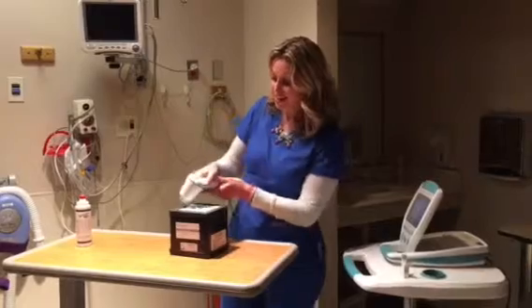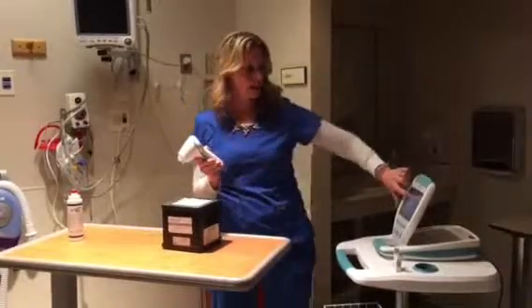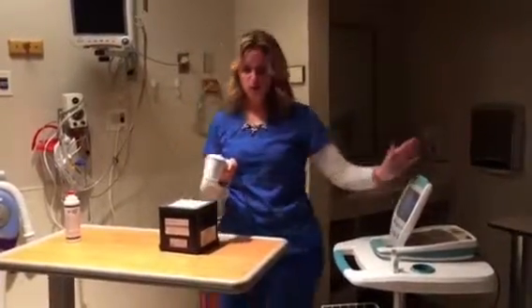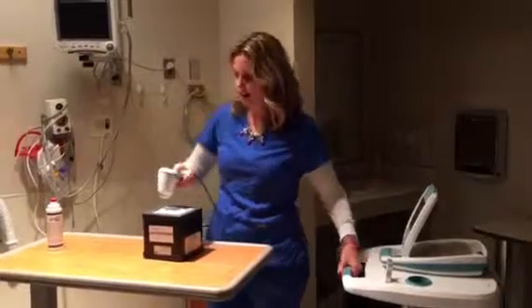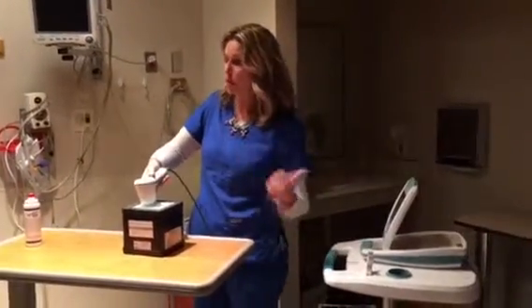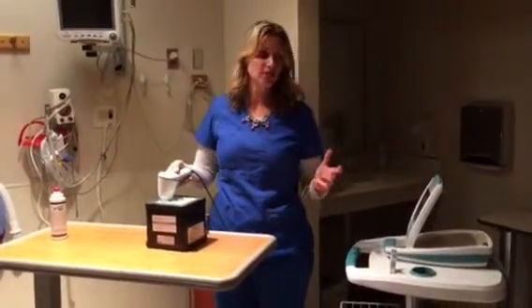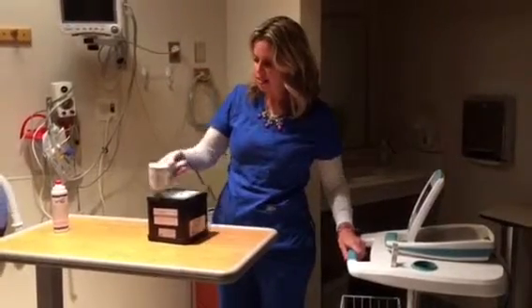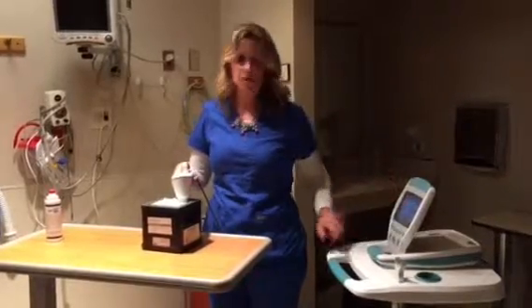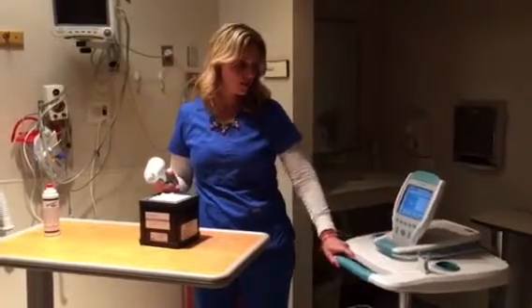And now I'm going to show you lastly how to get the bad reading and what I mean with the arrows. So I scan here, and I have an arrow pointing north, and then here on my probe I have the arrow pointing to the right, and it's flashing. So they're both pointing the same direction because I have the monitor in my left hand. Now all I'm going to do is significantly tilt my probe back towards the way that it's pointing me to. I'm not going to move it like this. If it's a solid arrow, it's just a slight tilt. A flashing arrow means a significant tilt. Sometimes I see it going around like this, and if you do that, you're going to see the bladder move in the crosshairs here. And lastly, to head back home, you can press this arrow here, and then you're back home.